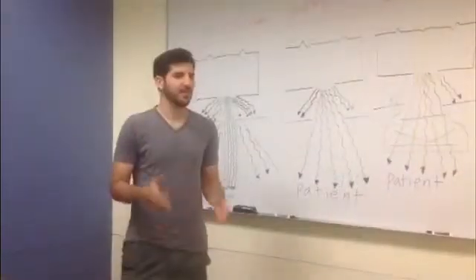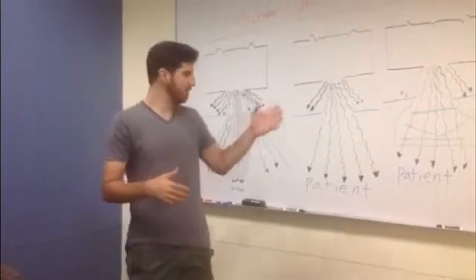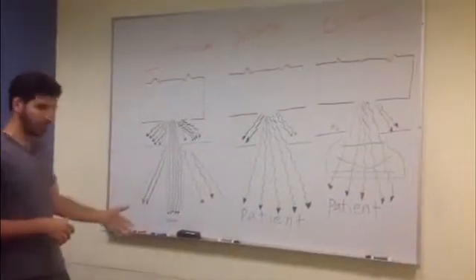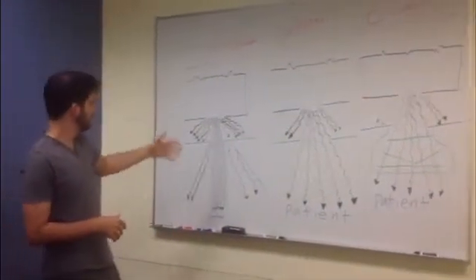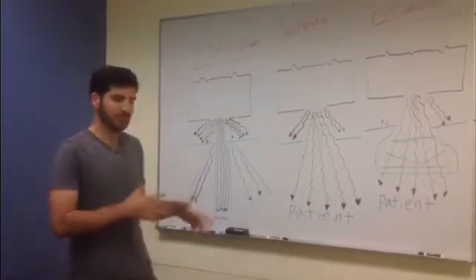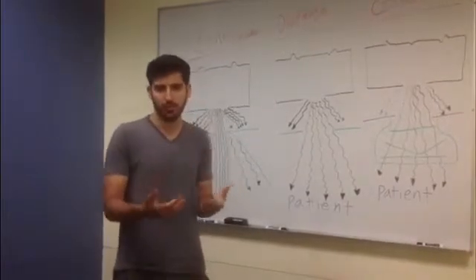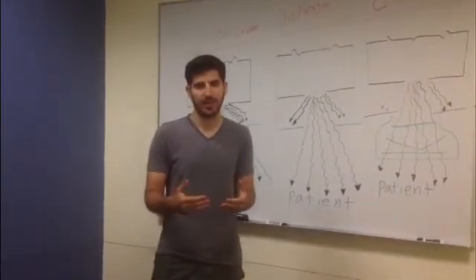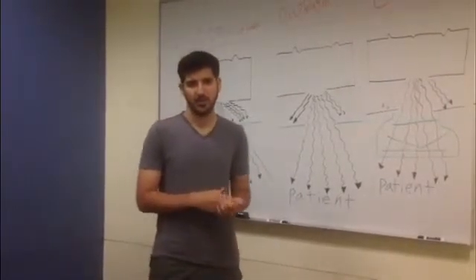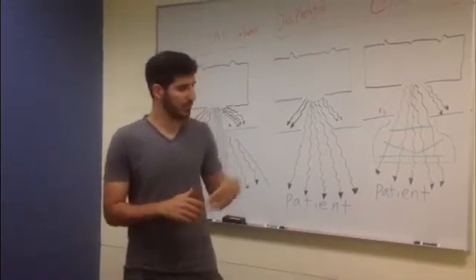You realize that there are certain limiting factors or limitations that each one of these devices have, such as the coned image that is produced with the cone beam restricting device, and there are several other factors that we hope could be improved in the X-ray field as there are more advances in technology, and more scientific discoveries that we hope to have in the future in the X-ray field.